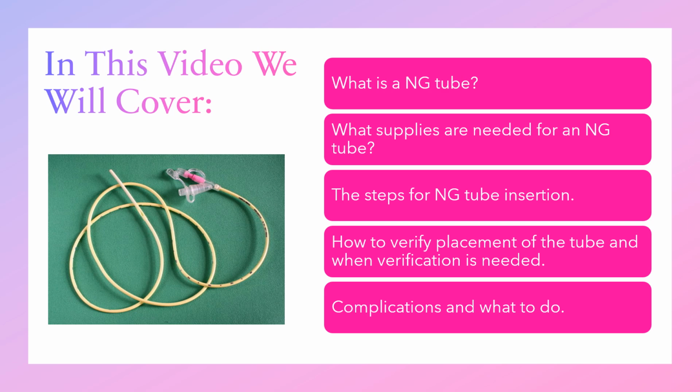In this video, we will cover what is a NG tube, what supplies are needed for an NG tube, the steps for NG tube insertion, how to verify placement of the tube and when verification is needed, complications, and what to do.